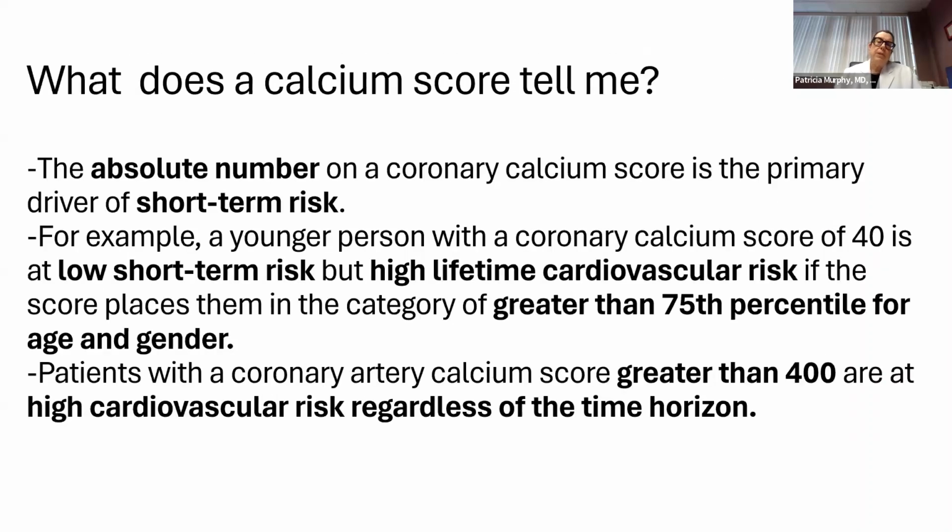So in terms of a calcium score, there is what's called an absolute number. That's 0, which is nice. There's less than 100. There's greater than 400. There are all these different numbers that we get, and it is typically reported per coronary artery, so individual numbers in each location, and then a total score, and then we'll give you a percentile.